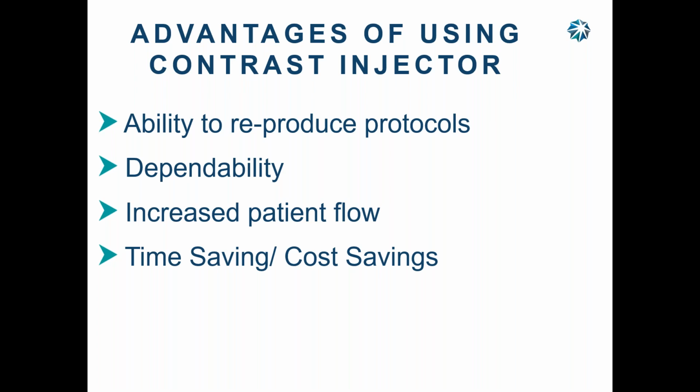You continue setting up the patient. You go start setting up the CT. You come back out. You disconnect the tubing, put your tubing on. Actually, you have to prime it first. Put your tubing on, connect it to the patient, and now you're ready to go. And that's how they work. Once the CT is done, you take off the 2 syringes, throw away the syringes, the rams retract, ready to go for the next time. You get rid of the patient. You send the patient out the door, and you do it all over again.